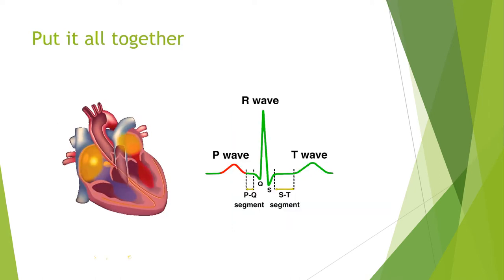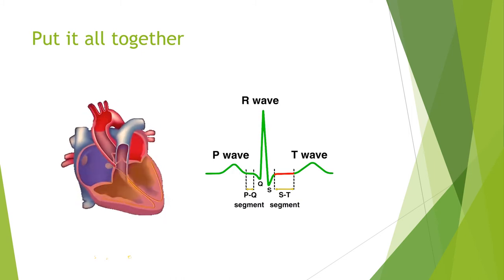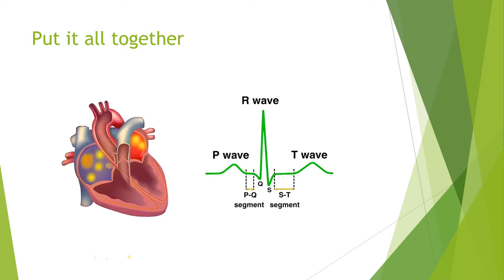So here we put it all together. P, Q, R, S, T. Top of the heart, P. Bottom of the heart, Q, R, S. As it resets, T.